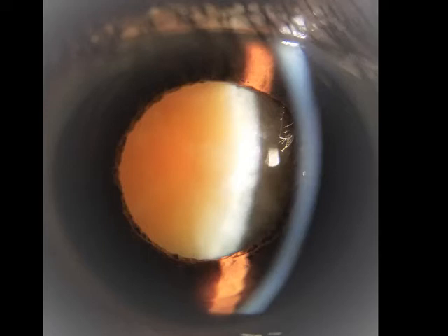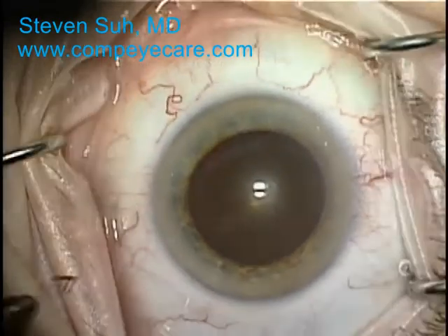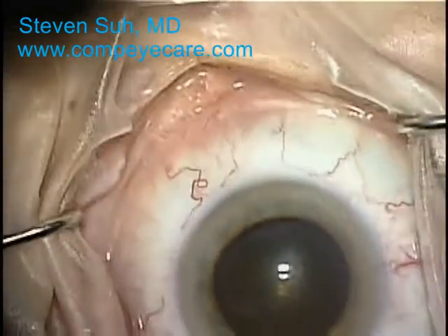Let's go ahead and start the video. It is in real time and it has not been edited. As you can see, the metal lid speculum is already in place.